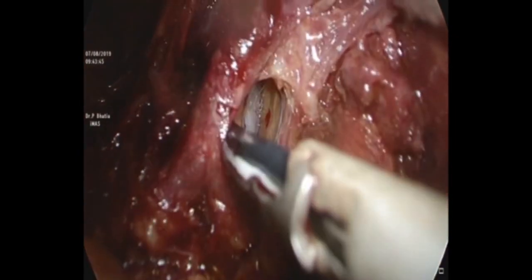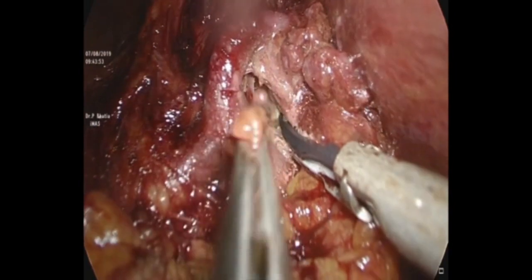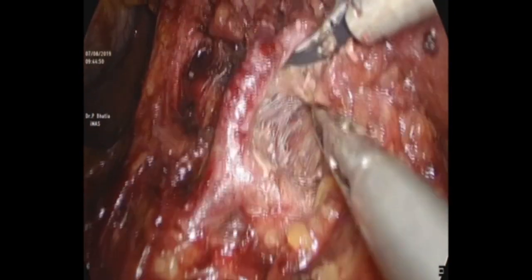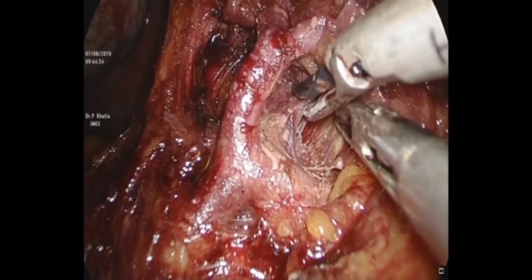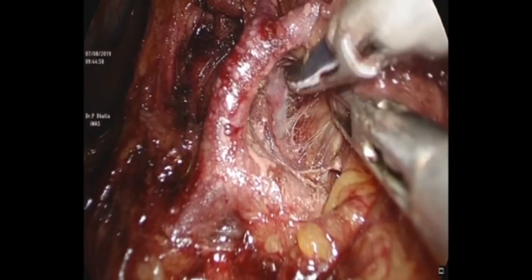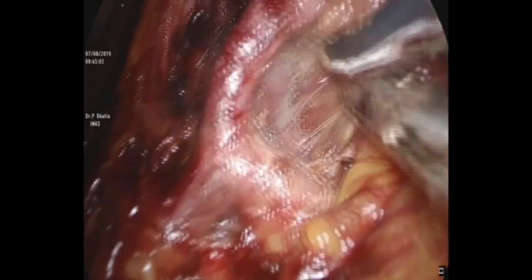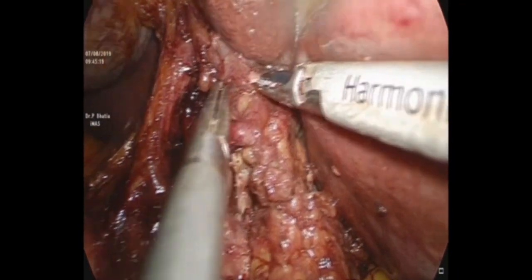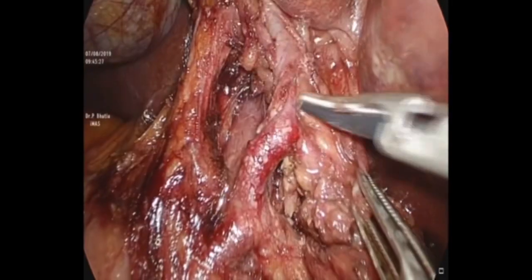We go into the retroportal vein area and take off all the fibro-fatty tissue there as well. The hilar plate is taken care of and all the structures are delineated in an anatomical fashion.